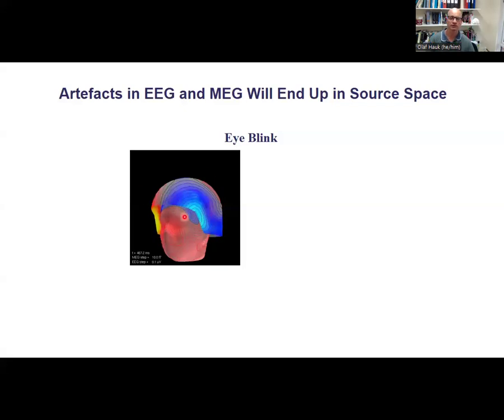These are magnetometers. If you apply the right-hand rule, the current flows out of the scalp, so basically just above the nose. Right-hand rule means that the magnetic field goes around the current. It points outward here, so that's why it's red here. It points inward here, that's why it's blue here. So MEG is sensitive to eye movements and eye blinks.